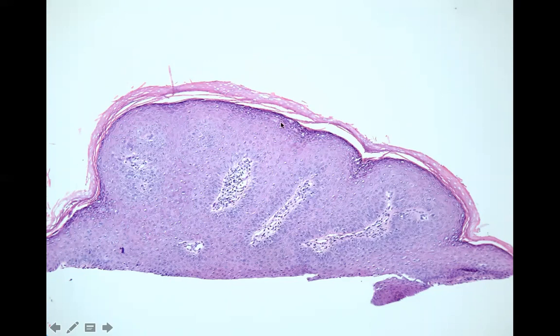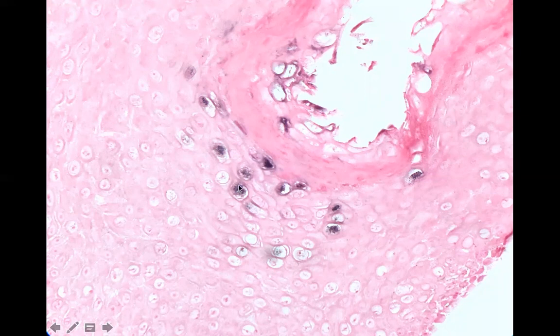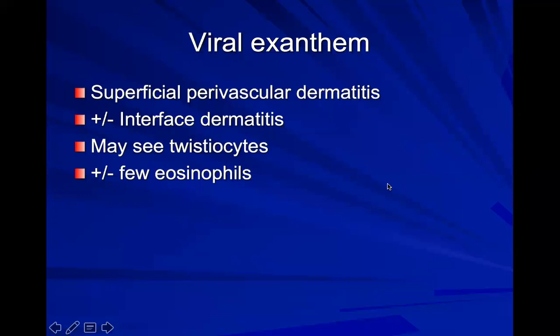And this condyloma has a little bit of active coilocytic change, so I would expect an HPV study to be positive. But remember, once you clear the virus and you're left with this shape, certainly sebs in intertriginous areas can look similar, or even taggy things. So sometimes it's hard for your pathologist to tell you if you're looking at a warty looking seb or an old condyloma, and your HPV study won't necessarily be positive if you've cleared the virus. But this one I would expect to be positive. And here is your HPV study. It's an in situ hybridization, and this is the positivity in the nuclei where you see those coilocytes.